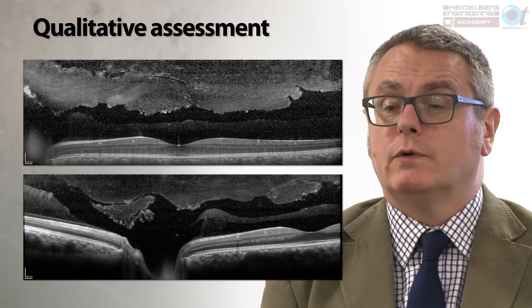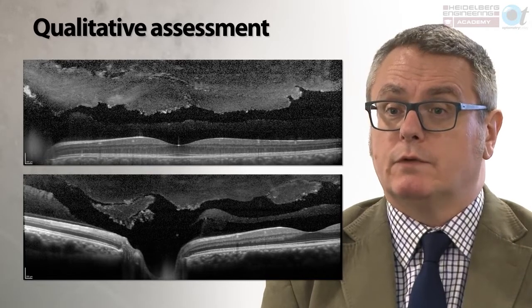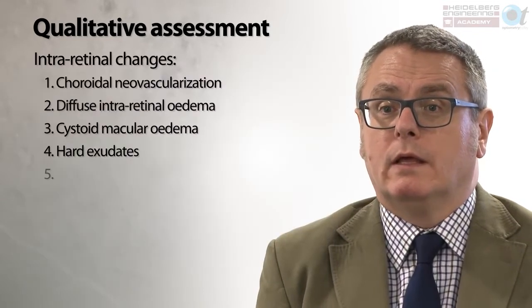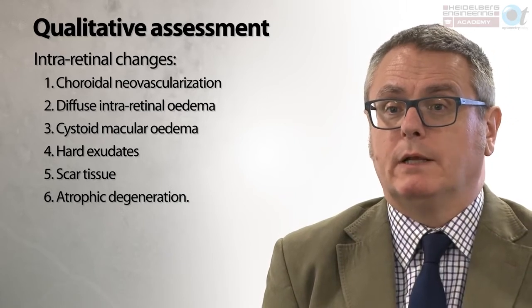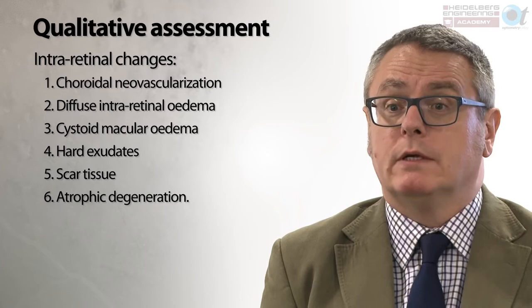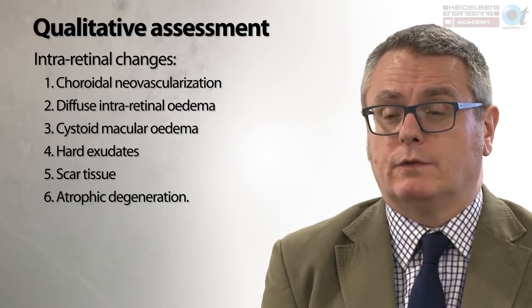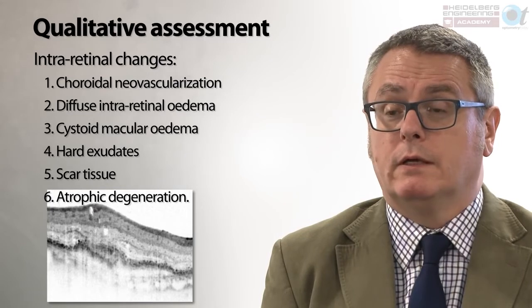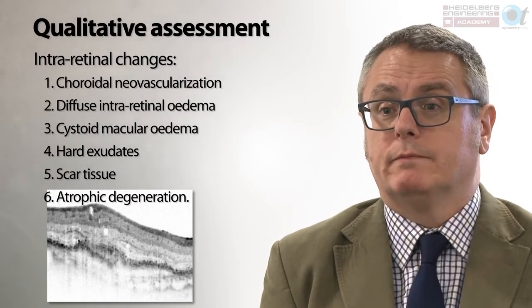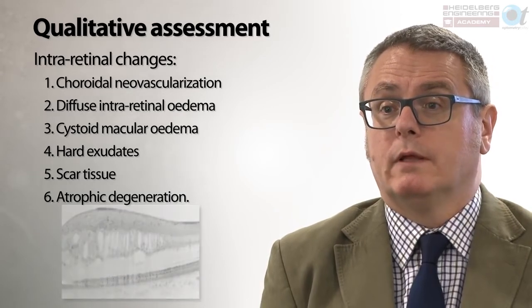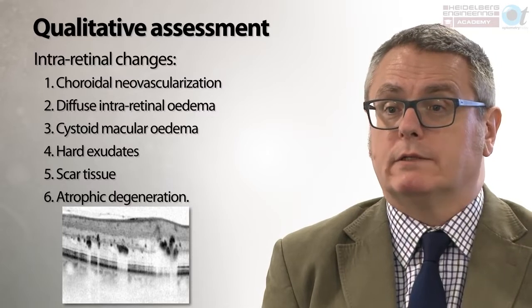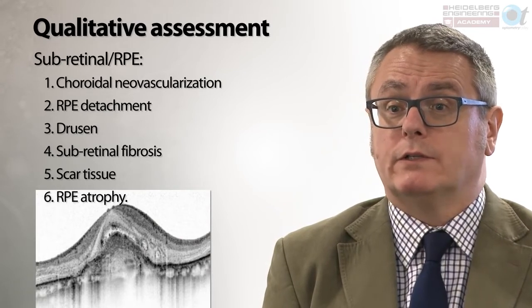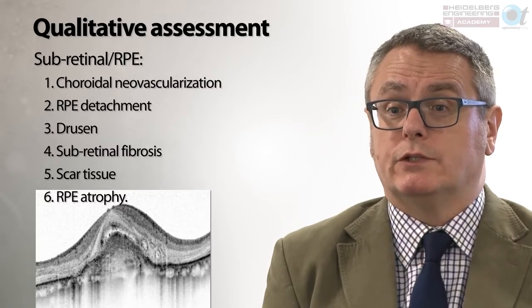By applying a plus-2 diopter defocus to your OCT scanner, you can move the sensitivity of the instrument into the vitreous cavity and almost render the vitreous opaque. Intraretinal changes to look for include choroidal neovascularization, diffuse intraretinal oedema, cystoid oedema, exudate, scar tissue, and atrophic degeneration. Choroidal neovascularization shows increased reflectivity in front of the RPE with associated intraretinal fluid; exudate has a very classical highly reflective appearance on the cross-section. In a subretinal location, look for choroidal neovascularization, RPE detachment, drusen, fibrosis, scar tissue, and atrophy.